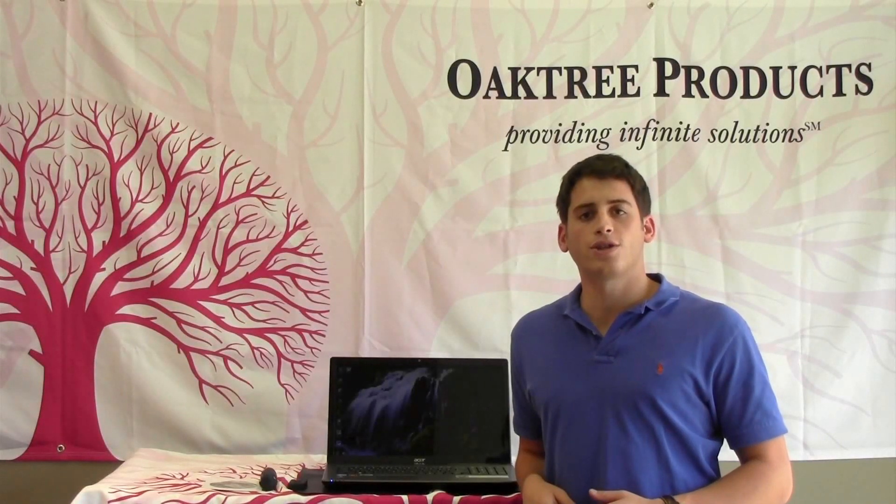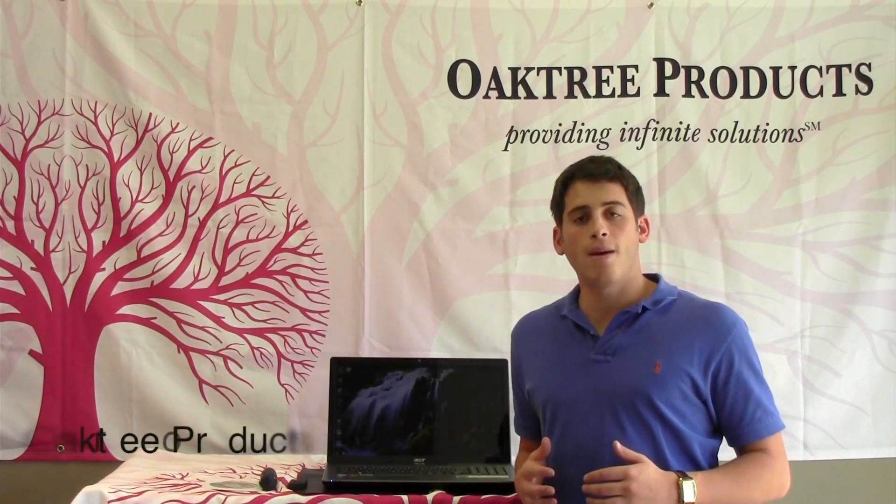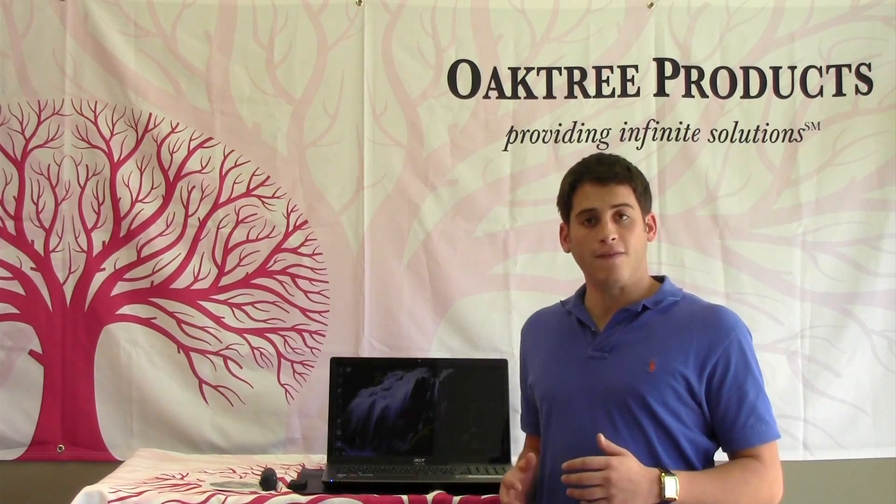Hi everybody and welcome to another edition of Oak Tree Products Quick Flicks. I'm Dave Kemp and today I'm going to be demonstrating a wireless digital otoscope that provides you with the flexibility to work with patients without the wires. It's called the Firefly DE-550 Digital Wireless Otoscope.